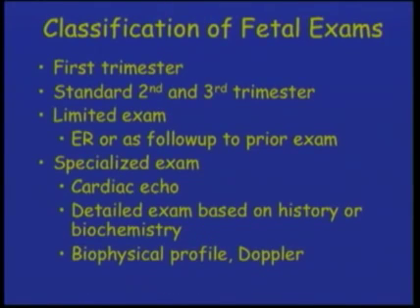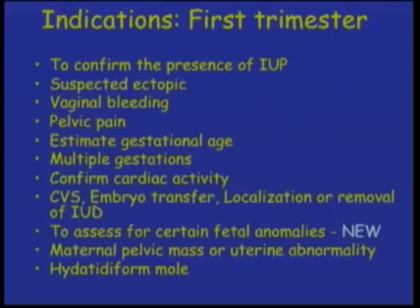The guidelines talk about a first trimester exam, then a standard second and third trimester exam, and then the limited exam, as we discussed earlier. Specialized exams are cardiac echoes, detailed exams based on history or biochemistry, like for alpha-fetoprotein or aneuploidy screening, and then specialized exams including the biophysical profile and Doppler studies.